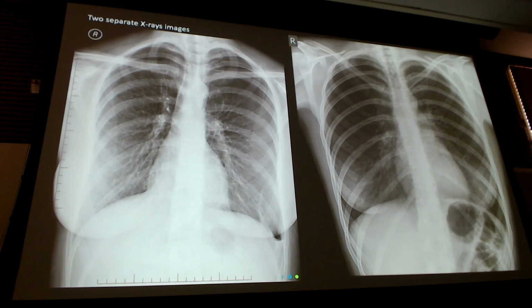On the left side, this one? Does that also have, because of the line that you have, right? So say that again, on the right lung, on the left picture. This line it has running through here. This guy here. No, on the corner.